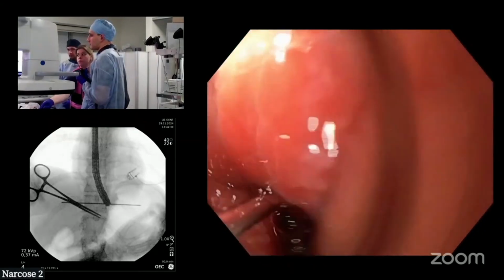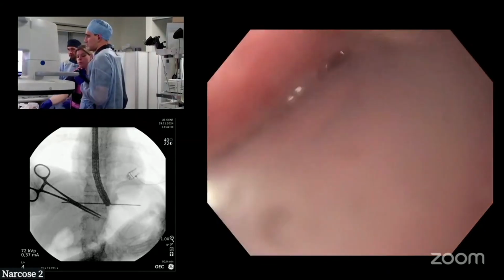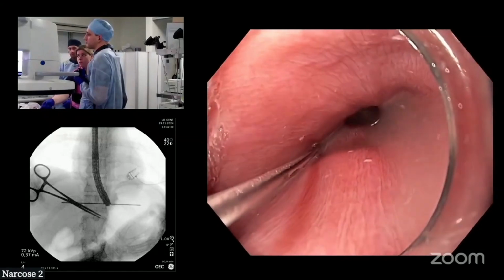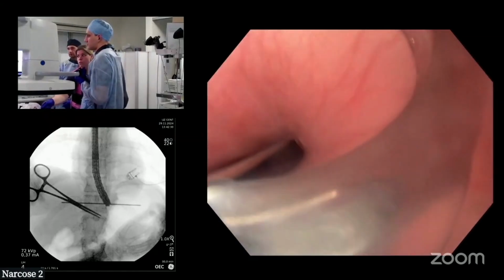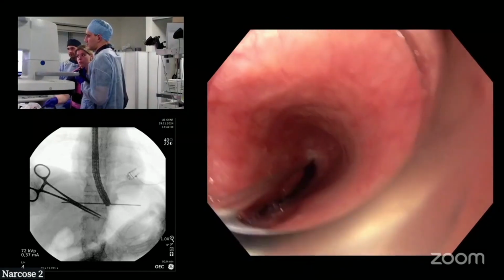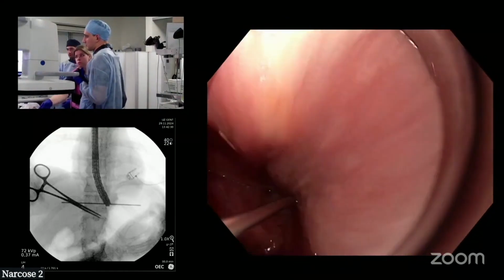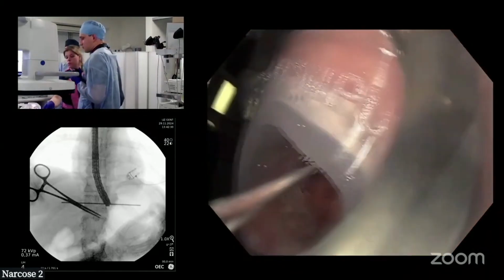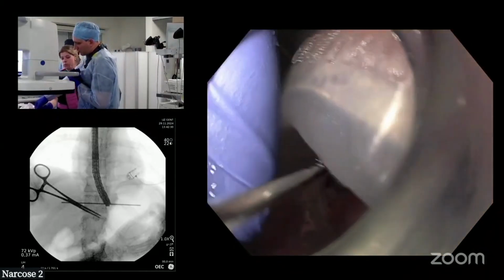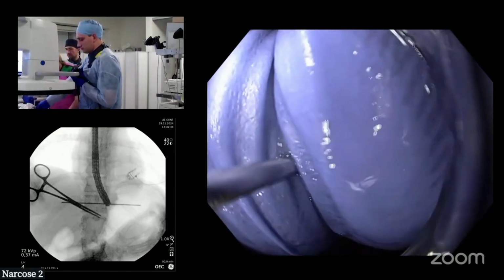Go, Michele, more. Yeah. Slower, please. More in. Yeah. To grab the wire at the mouth when it comes out. Michele, grab it. Don't let it go. And then take the scope off once we have marked it.